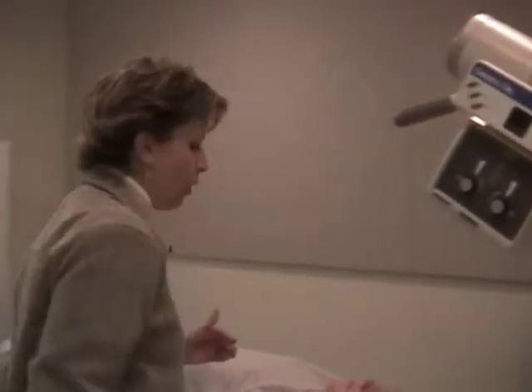Okay? Now I'm going to do a lateral. And there's many ways you can do the lateral. I'm going to just demonstrate one of them today. The purpose of the lateral, whatever projection you do, is to separate the two TMJs. In the lateral position, they're one right on top of another. And you have to do something to separate them.